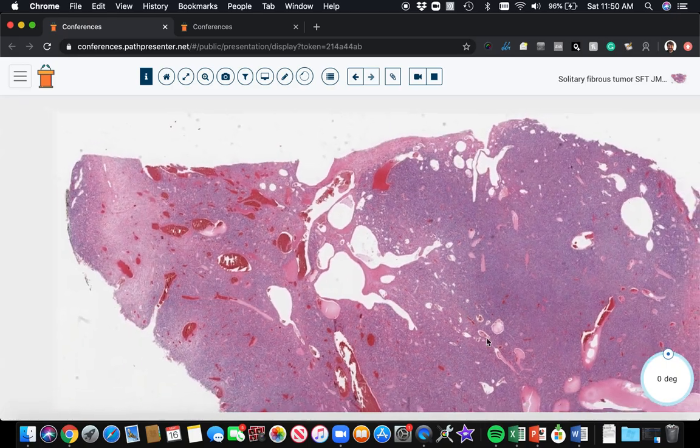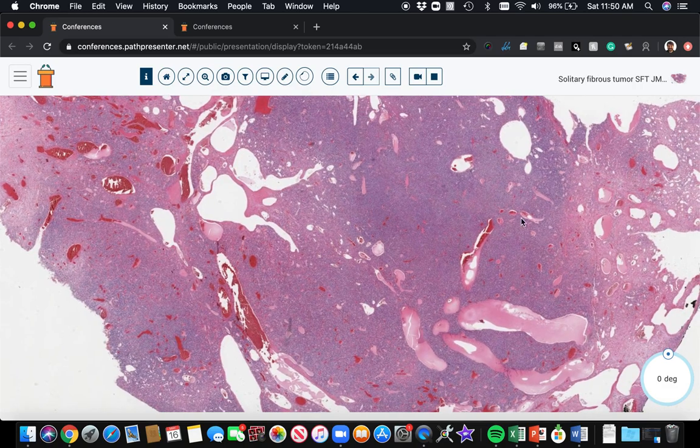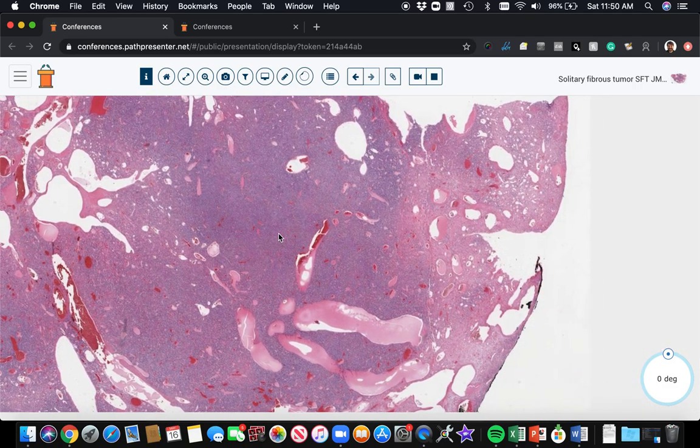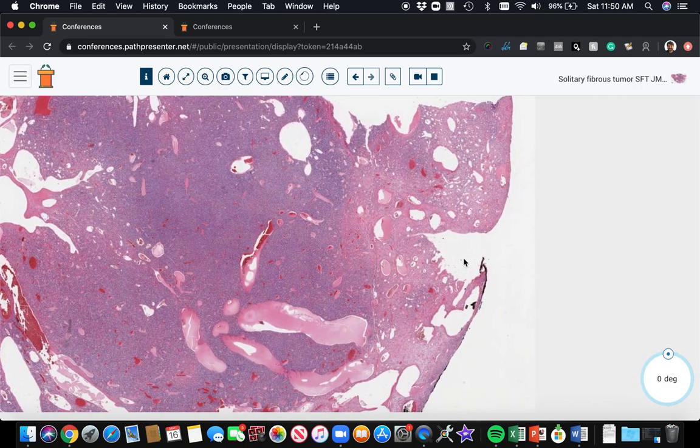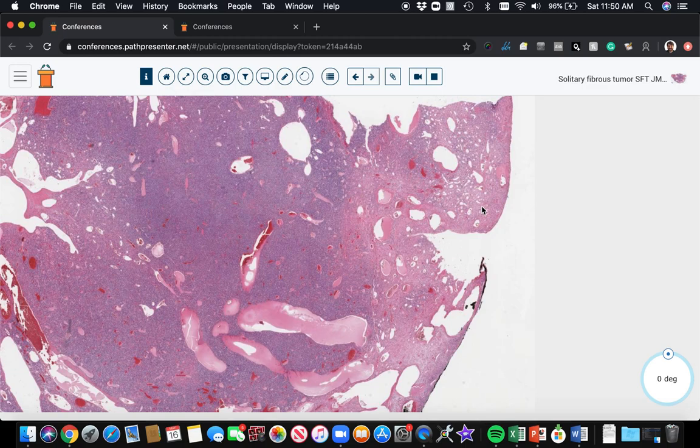The other thing is there's cellularity here. There's sheets of spindle cells in this area, and in these areas, there's a lot less cellularity. Look, it's more pink and less blue. So there's more cellularity here. Over here, there's more collagen and less cells, fewer cells.